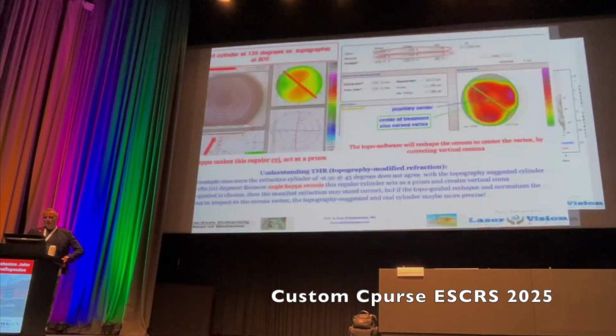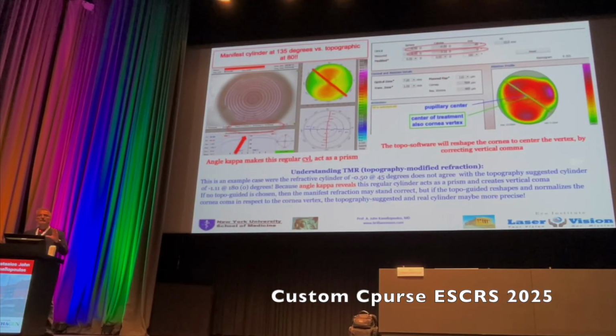I want to spend a few last minutes explaining TMR. I think this will explain the core of how customized treatments can help patients. Let's go step by step.